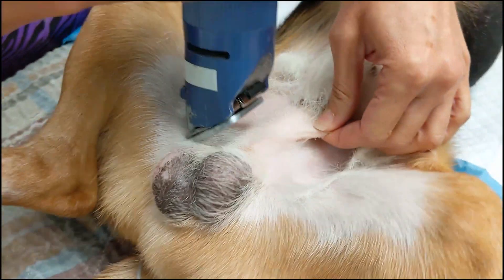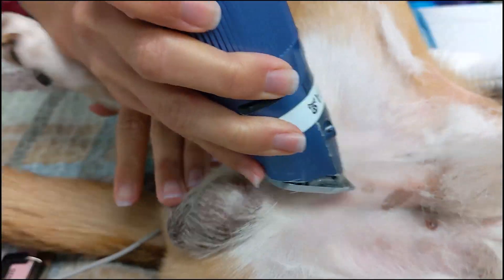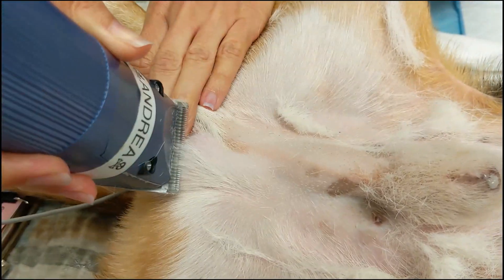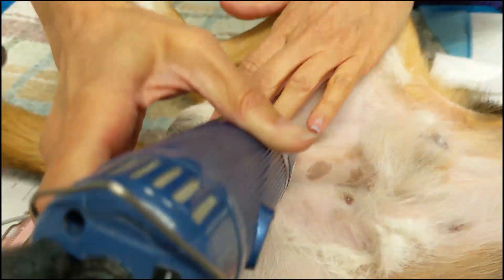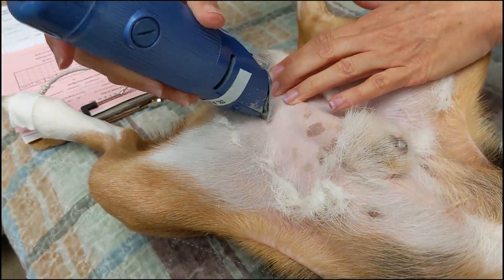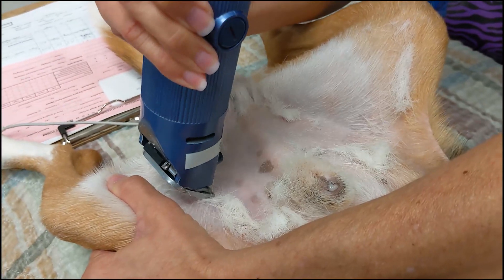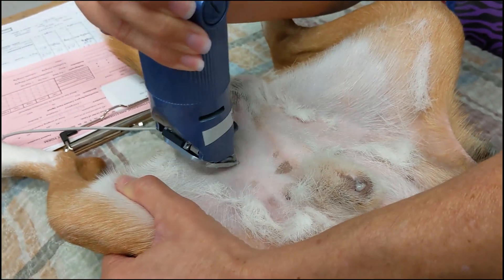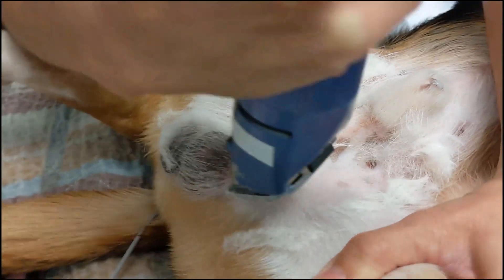Stretching the skin tight can help get a close shave without cutting the skin. On the left thigh here you can see we first start in the same direction as the fur, and then once it's shorter we stretch the skin and go against the hair grain to get a nice close shave without cutting the skin.